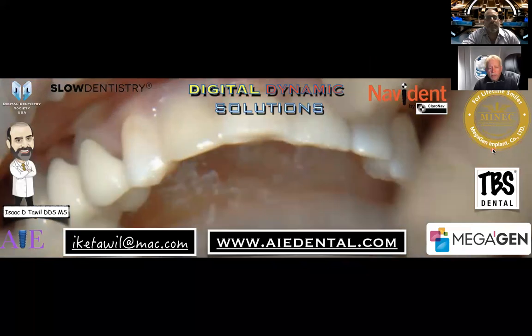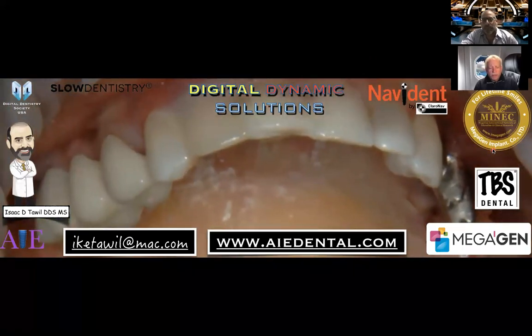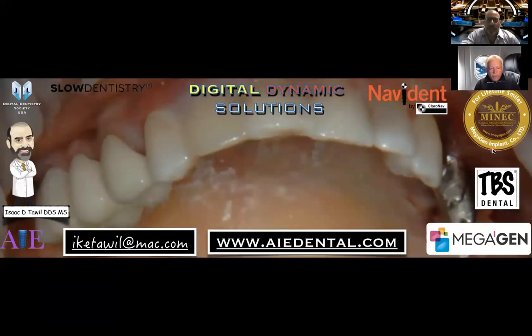So really an amazing amount of information that was really well documented. One of the questions from one of the participants was, and certainly everything is based on a cone beam CT evaluation, as you said, but how do you deal, if you're trying to do a socket shield type case, with a curved root?